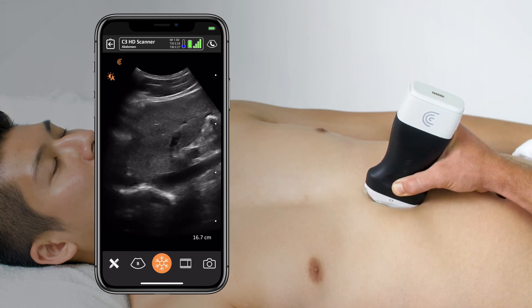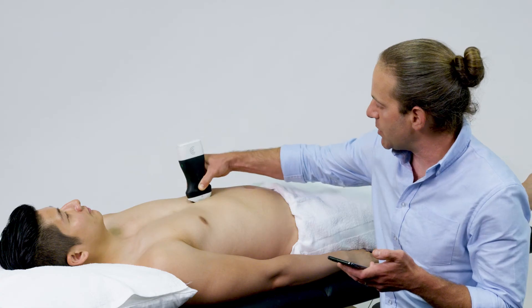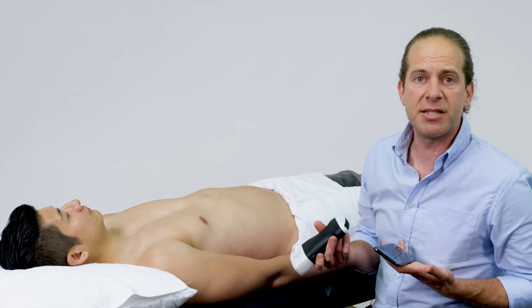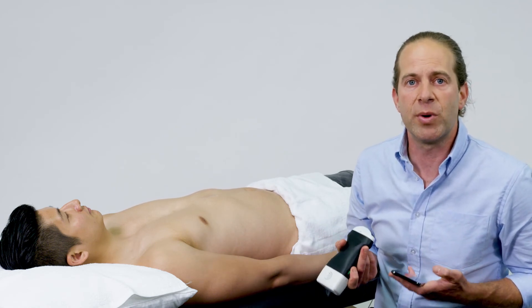I'll watch it through a couple of respiratory cycles to determine if it is fat or flat. And once I've watched a couple of respiratory cycles, I've made a pretty good assessment of the patient's central venous pressure and have valuable information about their clinical situation.